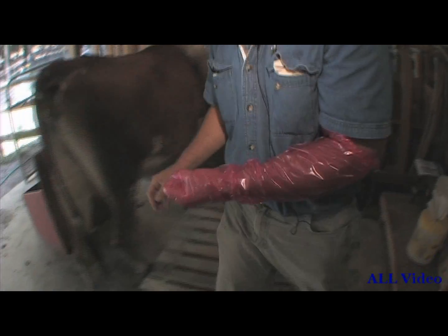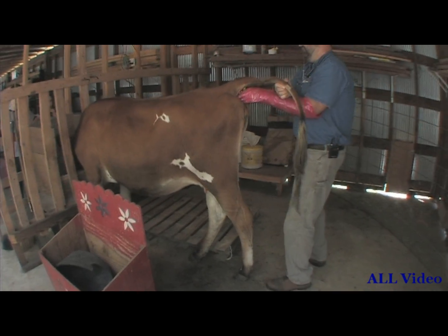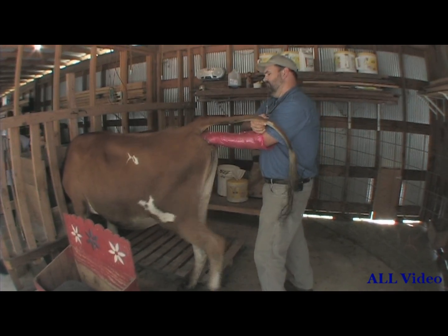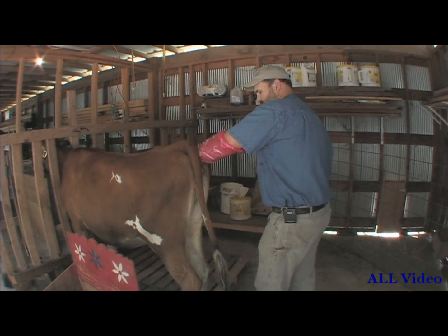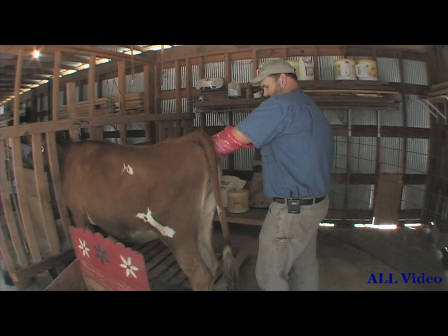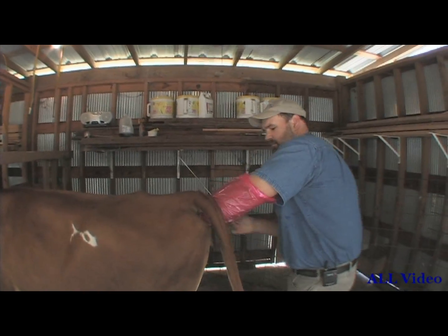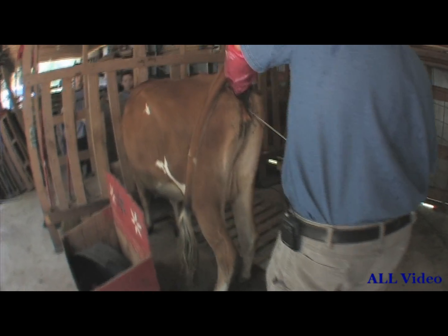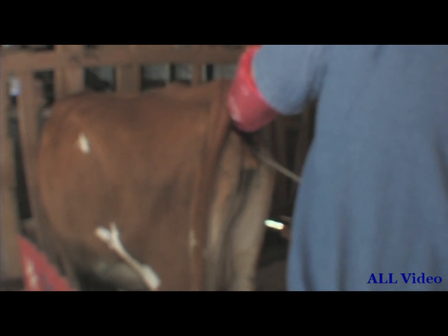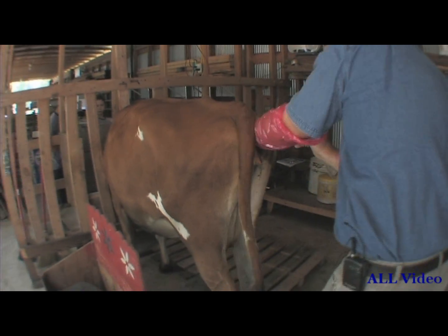All right, now get her tail out of my way — like this. There's her rectum right there. All right, girl. The problem with this bladder insertion is that if you're not careful, you'll stick this syringe in her bladder. So when you start putting it in, come up here like this — just like that. It's clean; sometimes you have to wipe her down, but that's okay. Start low like that. Guide it in — that way you don't put it in her urethra.